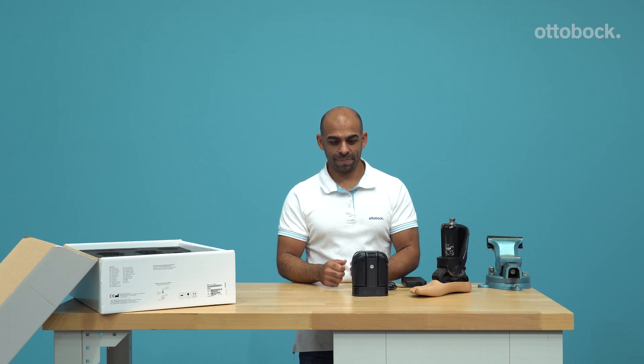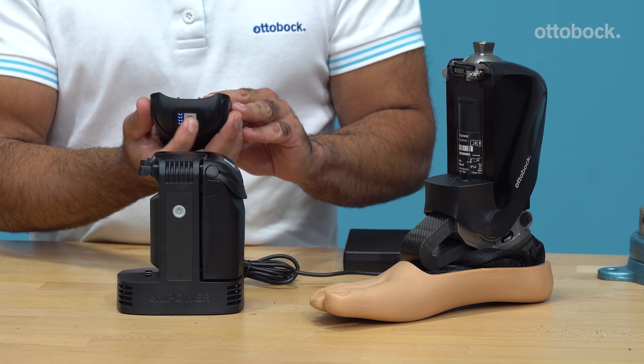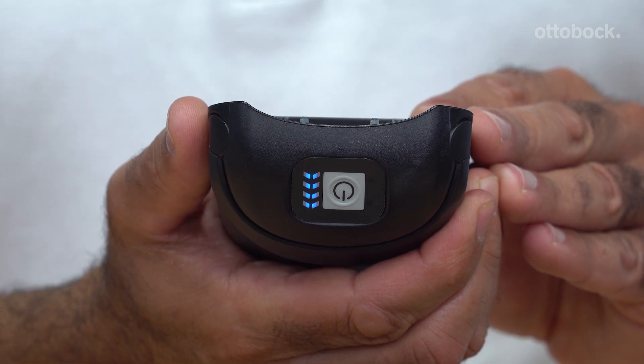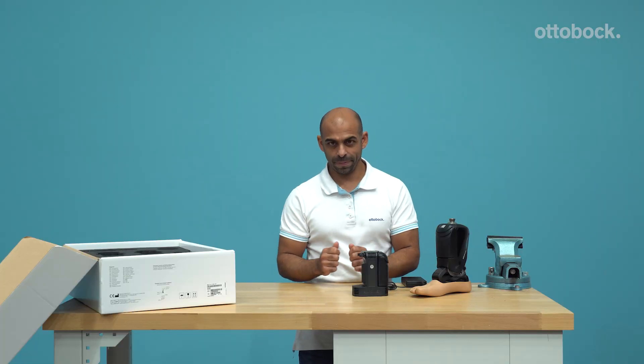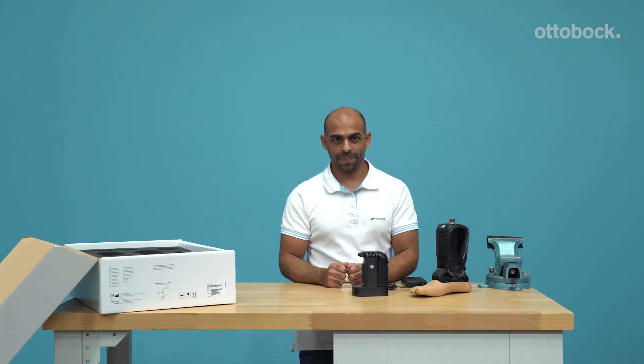To assure the battery is fully charged, briefly press the power button on the battery. The blue LED lights will display the current charge level. Four LEDs indicate a fully charged battery. Insert the battery into the receiver of the ankle.